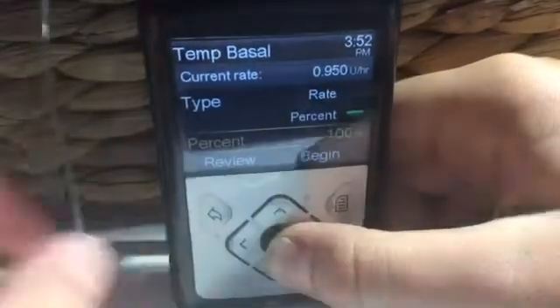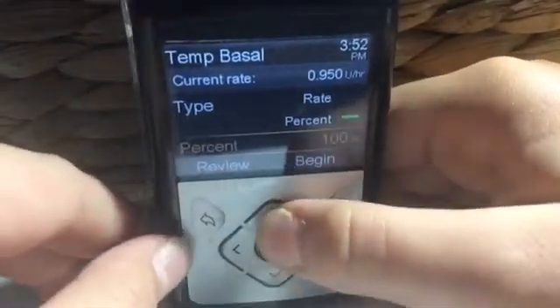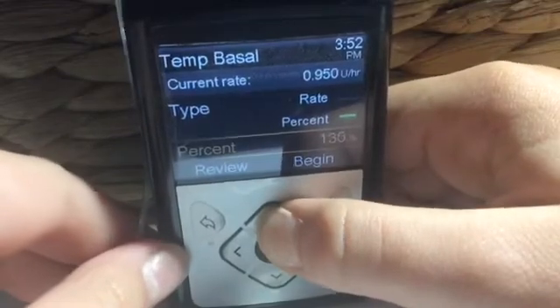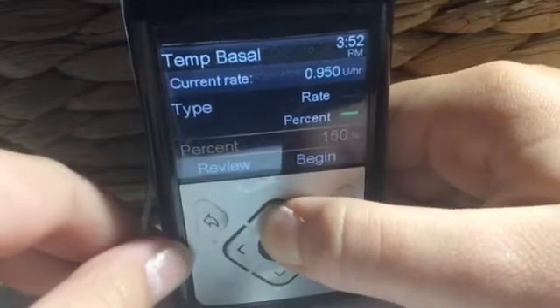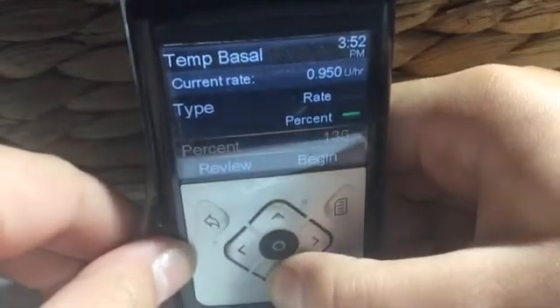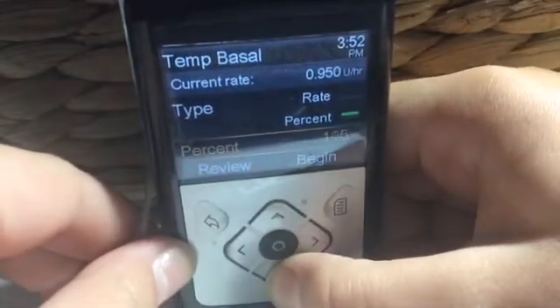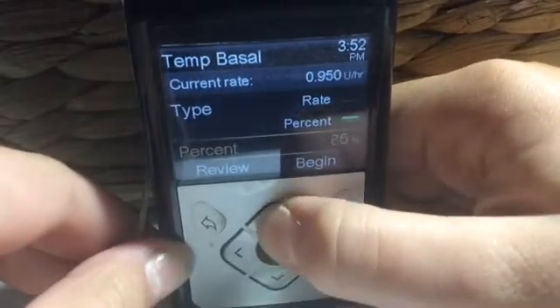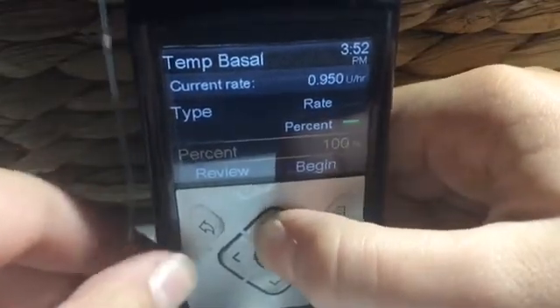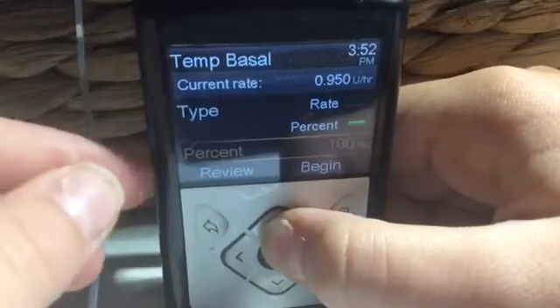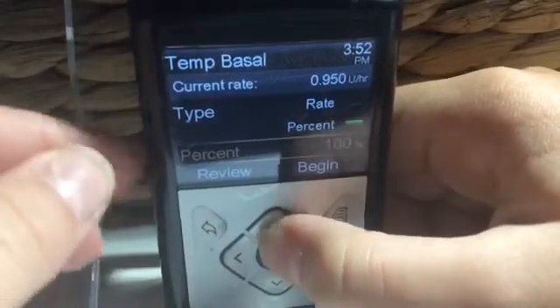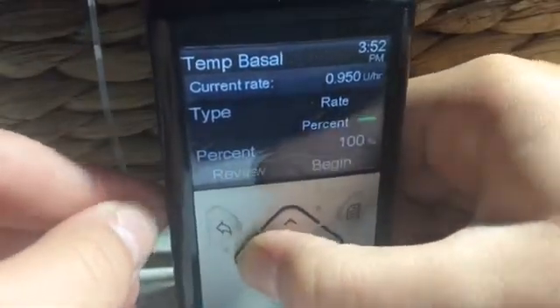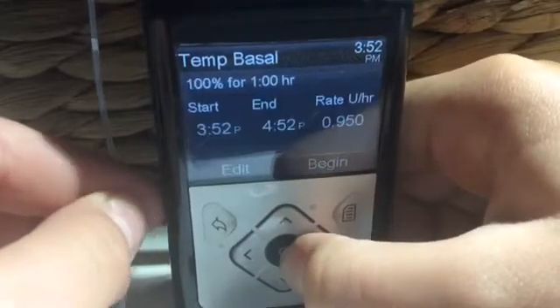Then you type in the percentage — whether you want it to go less or more, as much as up to 200, so 145 or whatever, and you can take it down to 60 or whatever you want it to be. In this section you can also review your temp basal by going down to review, as you can see here.